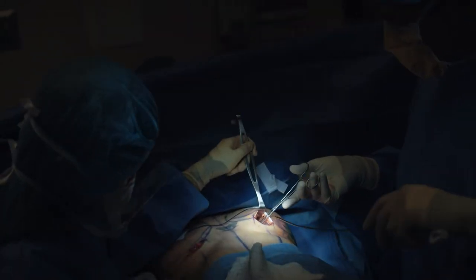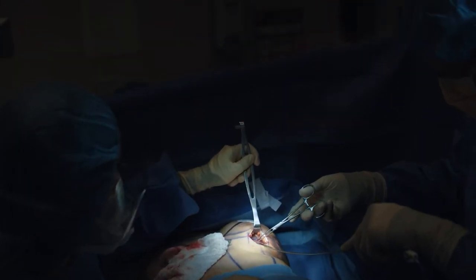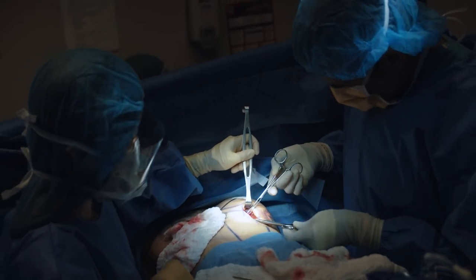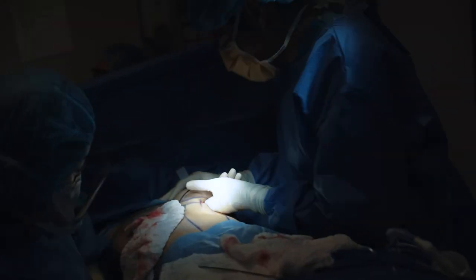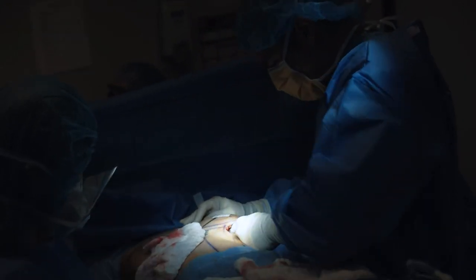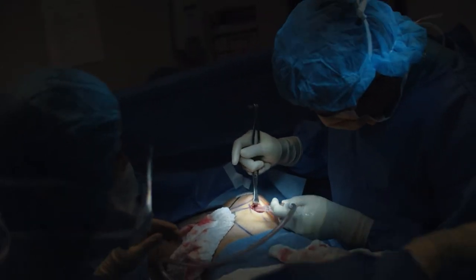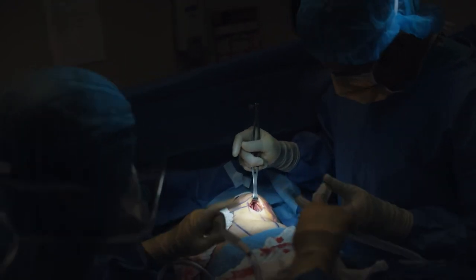And now we're going to put our numbing solution underneath the muscle. Now we're going to go underneath the muscle. Now we're going to dissect our pocket and sweep on top of the ribs underneath the muscle. You see there's very minimal bleeding because of our technique. Now we're going to put some tumescent in there.